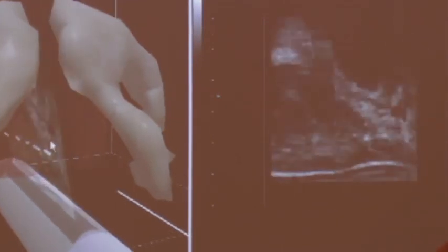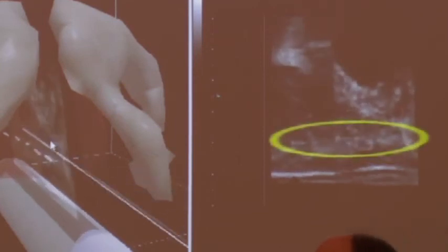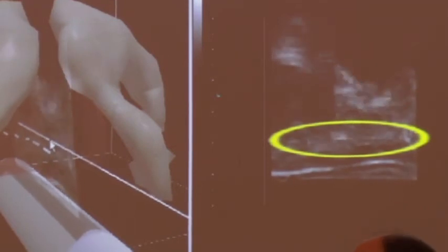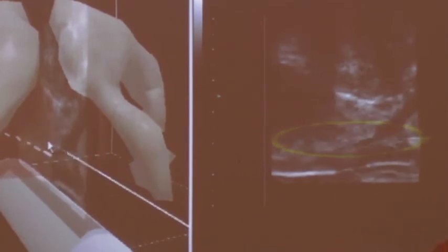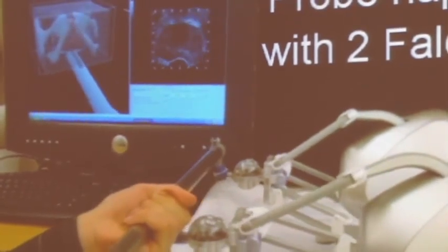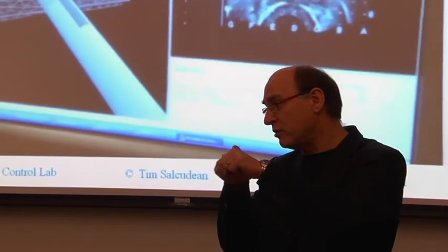Furthermore, the treatment plan that they generate does not include the deformation. As you poke the needle in, the prostate moves a bit. So when you look at the x-rays at the end of the procedure, all the seeds are spread a bit like this, instead of being perfectly parallel, because there is an anchor point, a little less compliant, anterior to the prostate near the pubic bone.